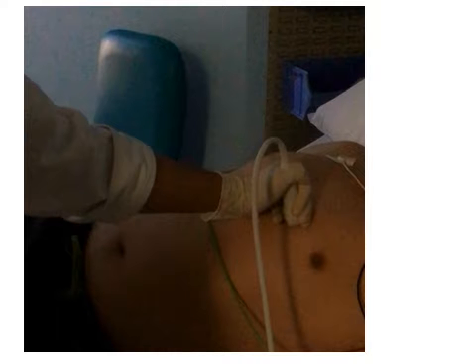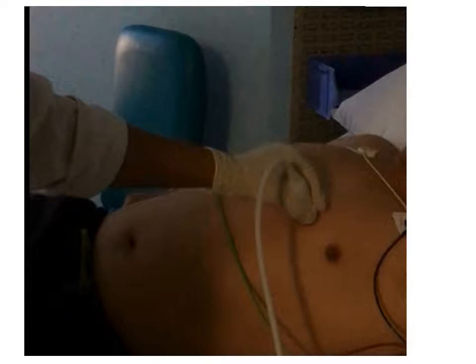Because if you don't do that, if you do like this, where your wrist is getting off the patient's chest or just about, you're going to develop a very sore elbow, and you're going to develop a very sore shoulder while you're scanning. On the other hand, if you don't hold the probe in a proper way, then what you might end up doing is putting too much pressure onto the patient's chest, and they are not going to like it.